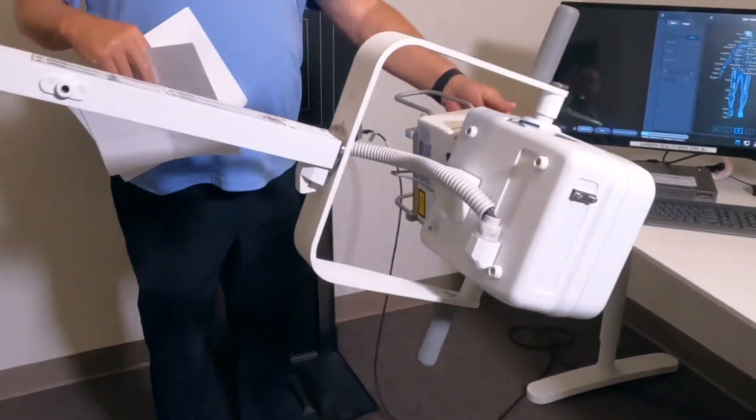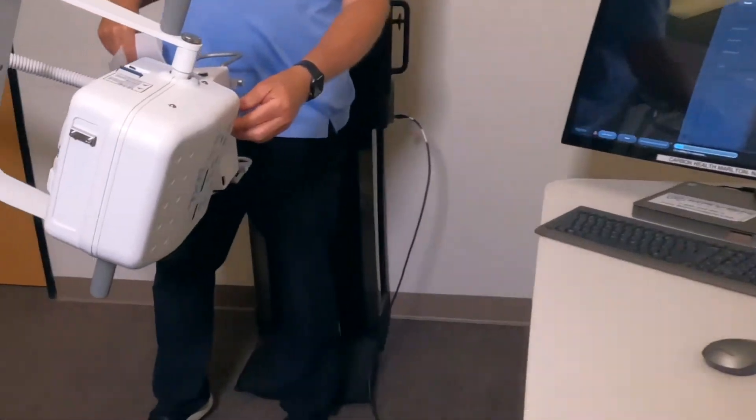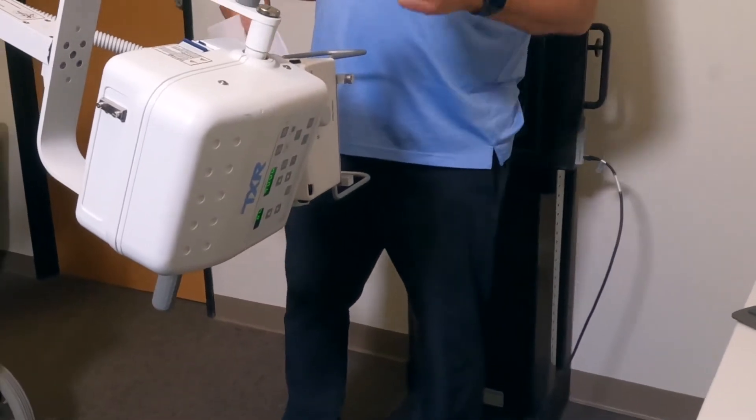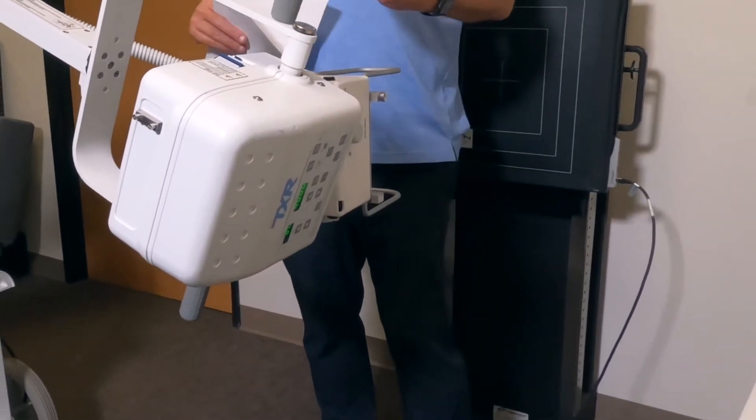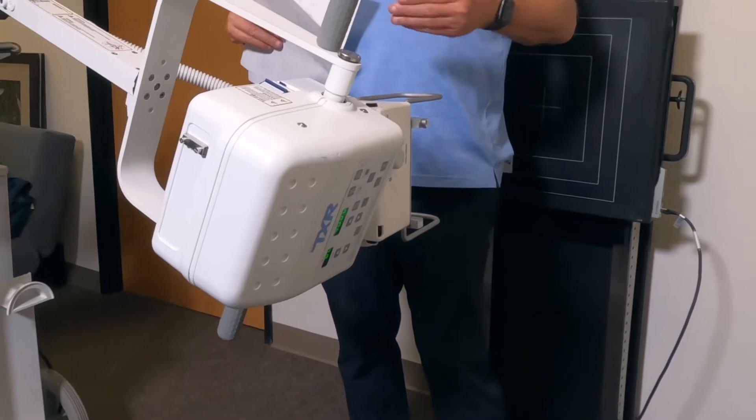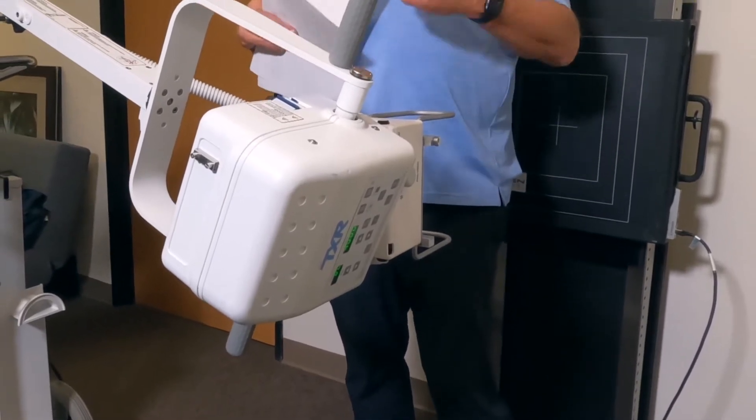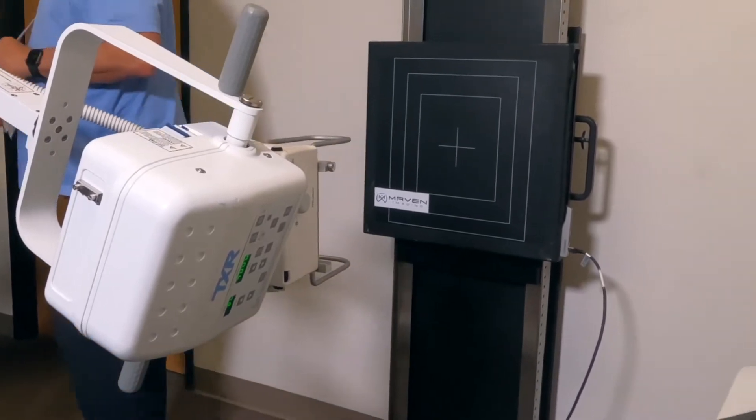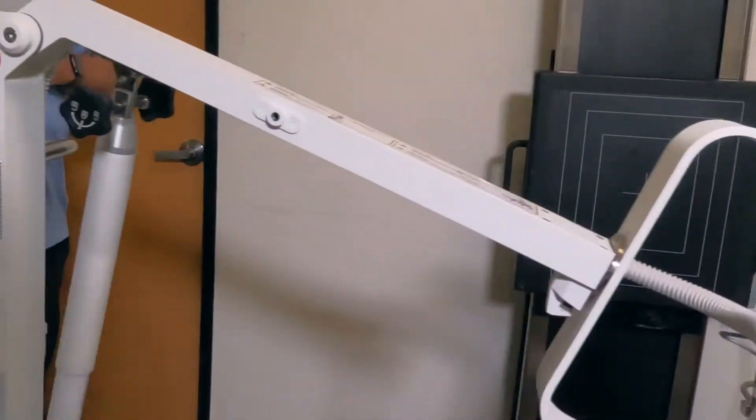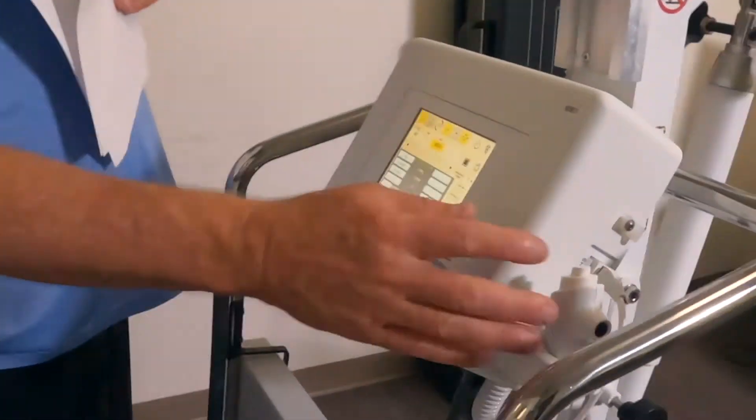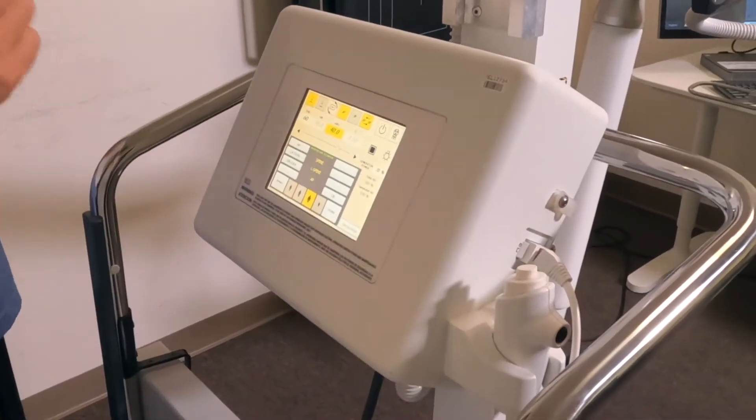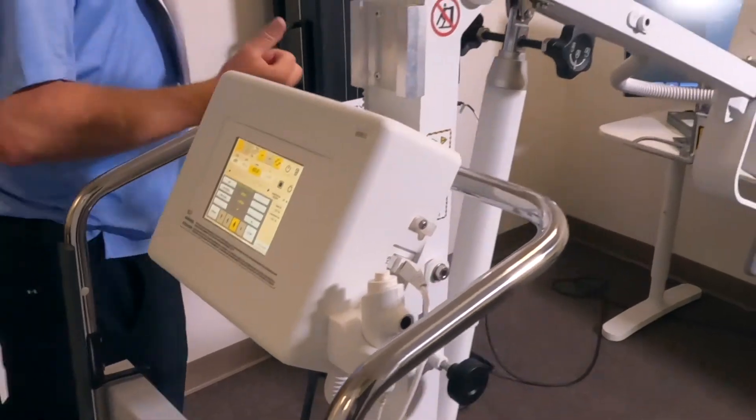One more thing—we come over to the collimators on the side, the little dials. What we do is close the collimator settings so that there is no light coming through the x-ray. Then we come back over here to the trigger switch, stand behind the lead shield, and take one shot. One shot will warm the x-ray up.